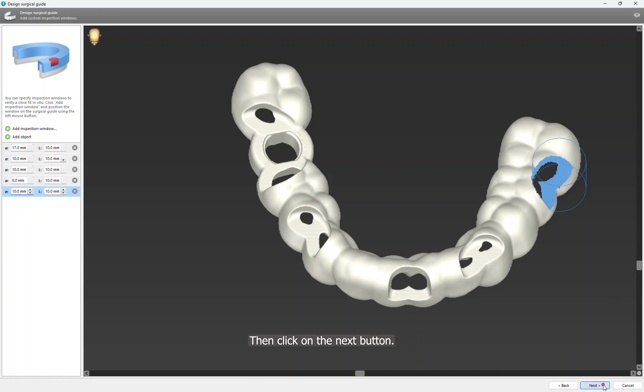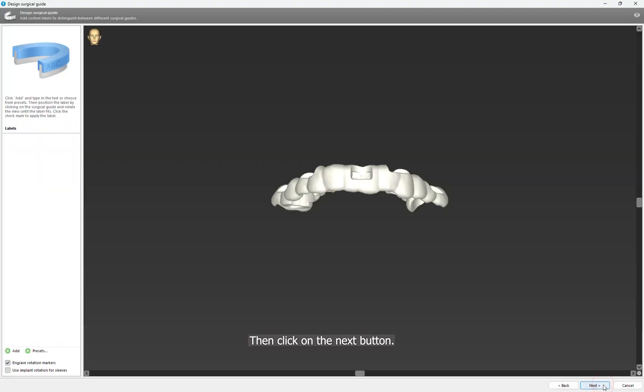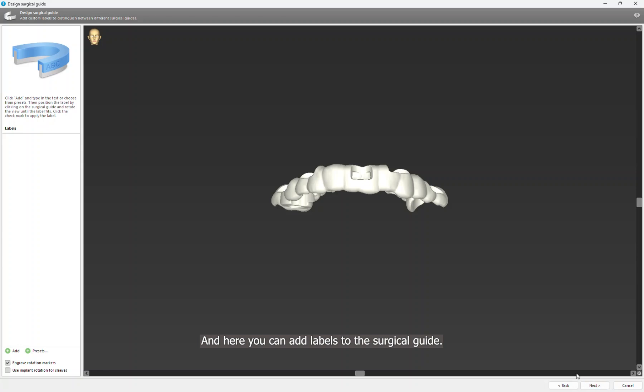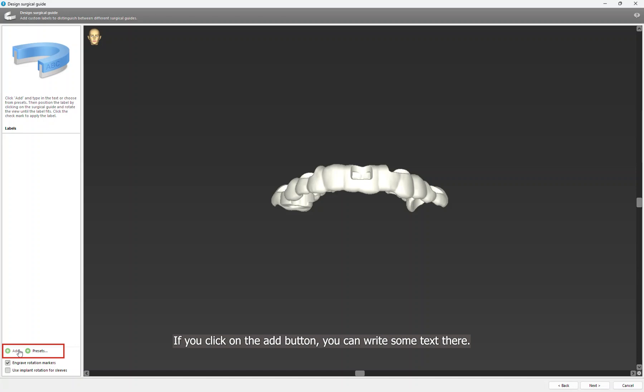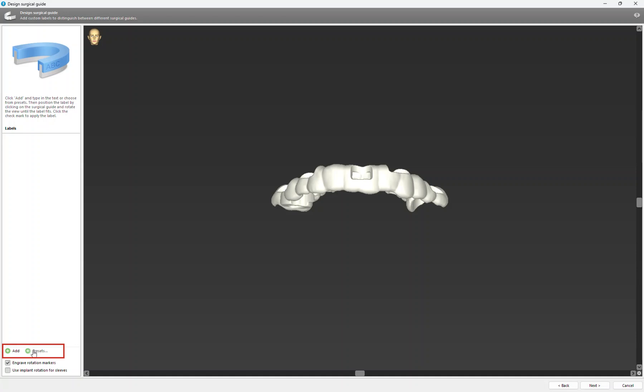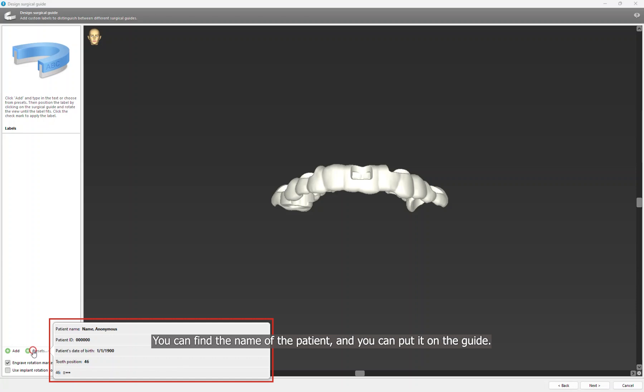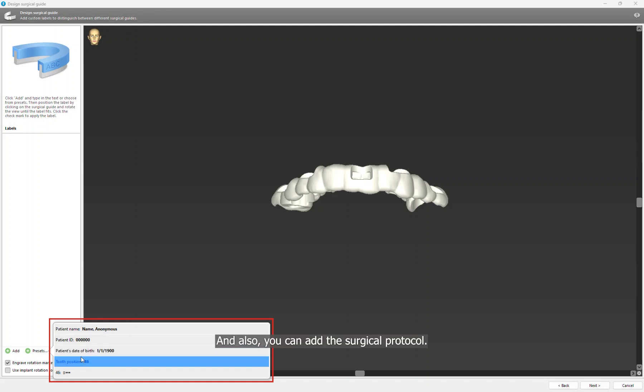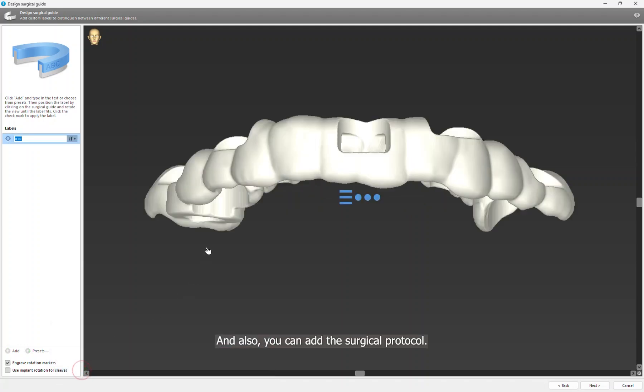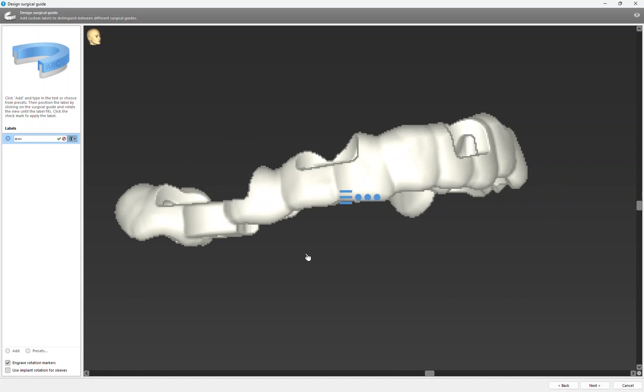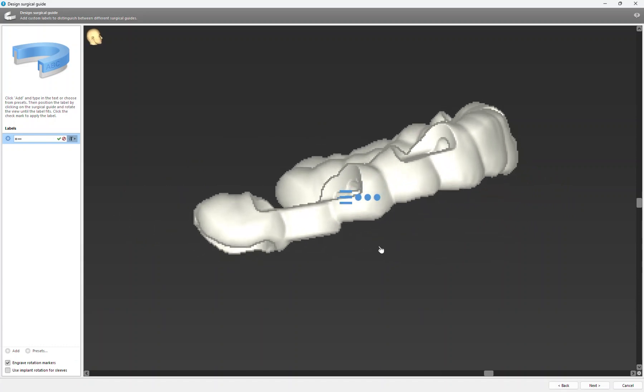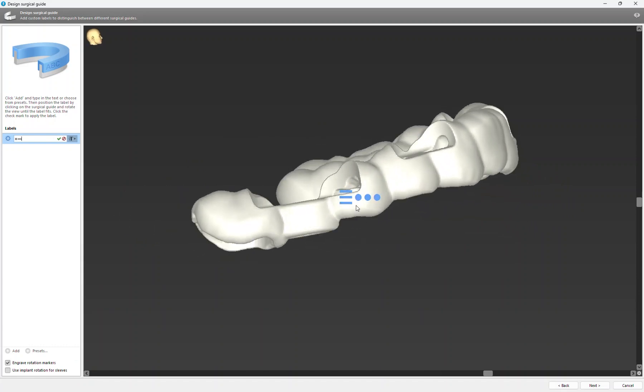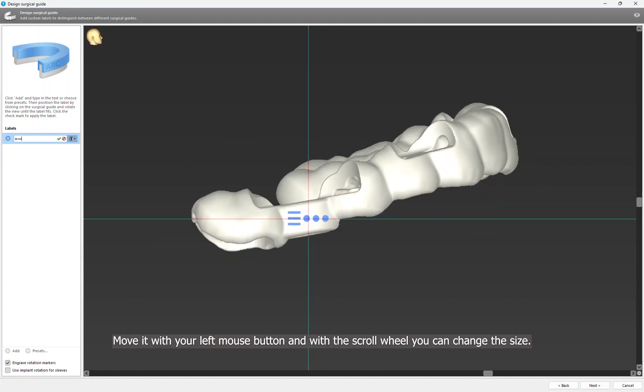Then click on the Next button, and here you can add labels to the surgical guide. If you click on the Add button, you can write some text there or you can use the presets from the CT or CBCT. You can find the name of the patient and you can put it on the guide. And also you can add the surgical protocol. Move it with your left mouse button, and with the scroll wheel you can change the size.